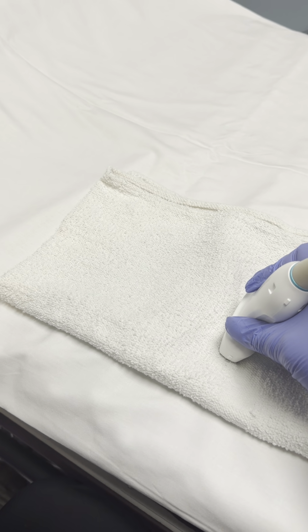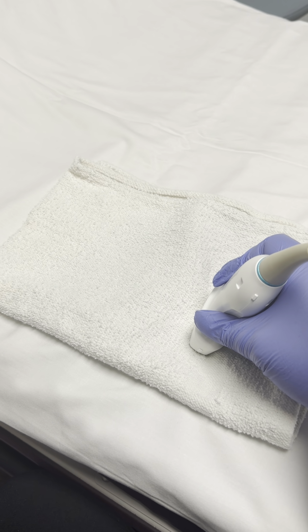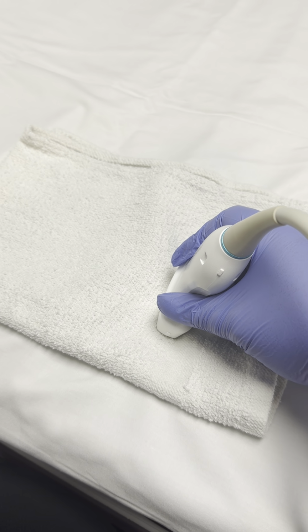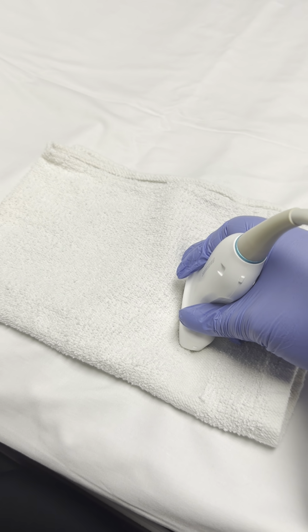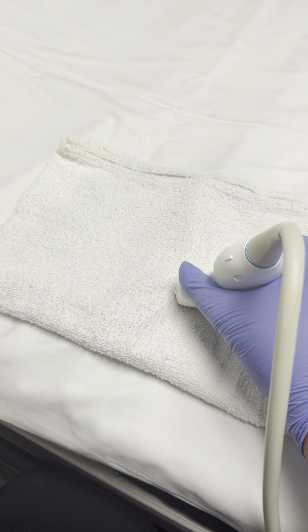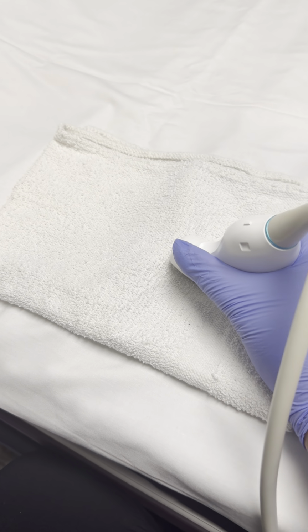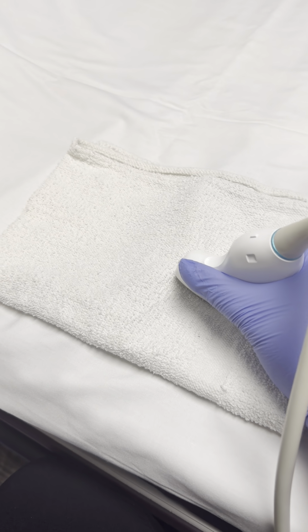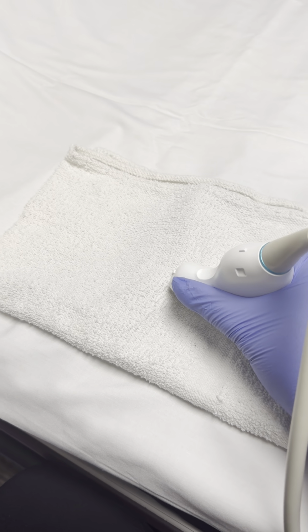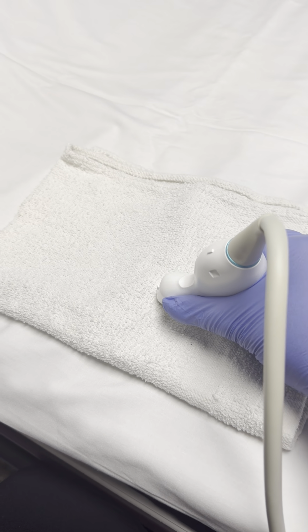Now say we did our standard sweep. Now we want to perform the sagittal views. As we want to get the aortic arch, I usually start like this and then elongate it to here. Now you kind of have to do a heel toe sometimes, occasionally, to visualize the head and neck vessels, just to get a good clear visualization of those vessels for the aorta.